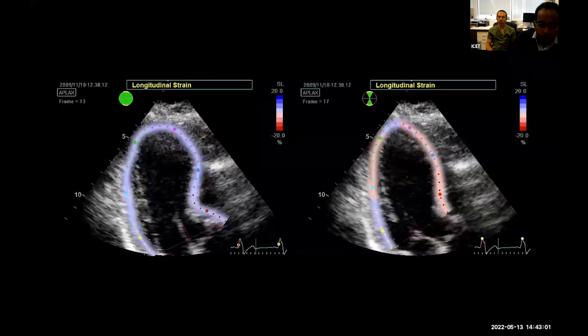Sorry, Shanthosh, one more question. When you do the final analysis or final picture, how much do 2 people agree on the placement of the band or thickness? That's very subjective again, isn't it?